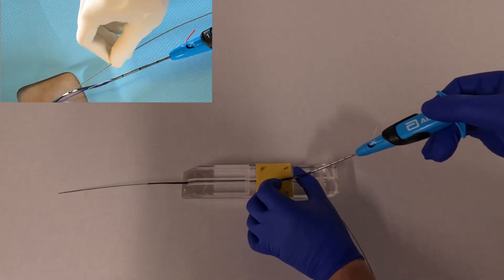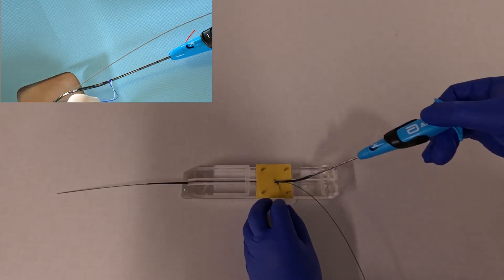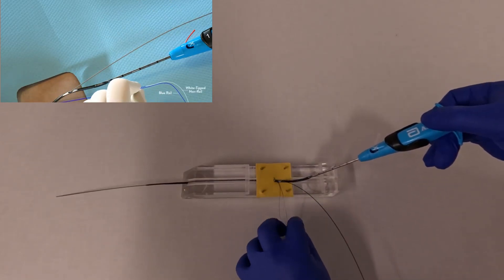At this point, the sutures are available on the side of the device so you can grab those and pull them out so that they're free.